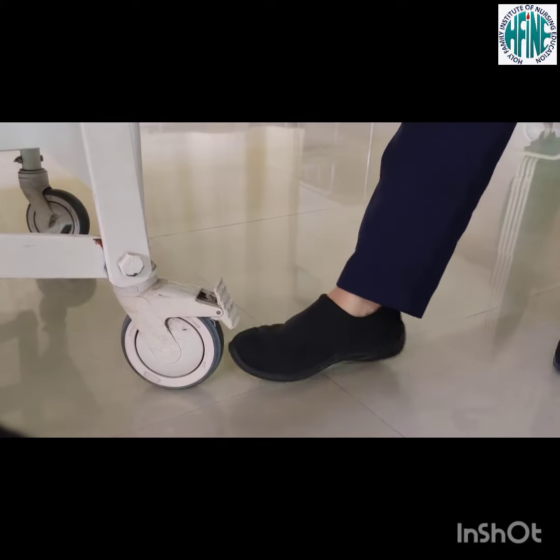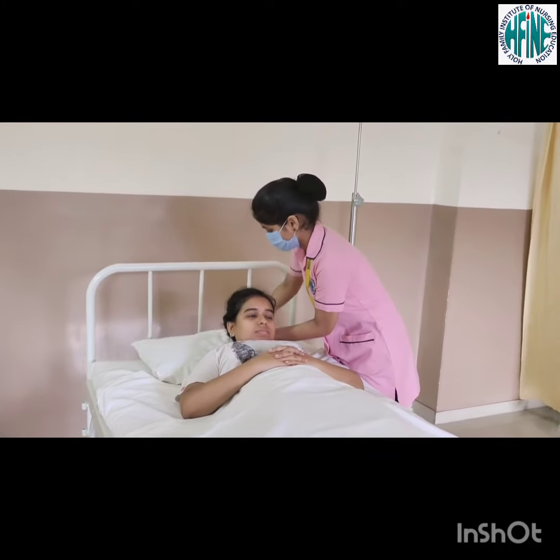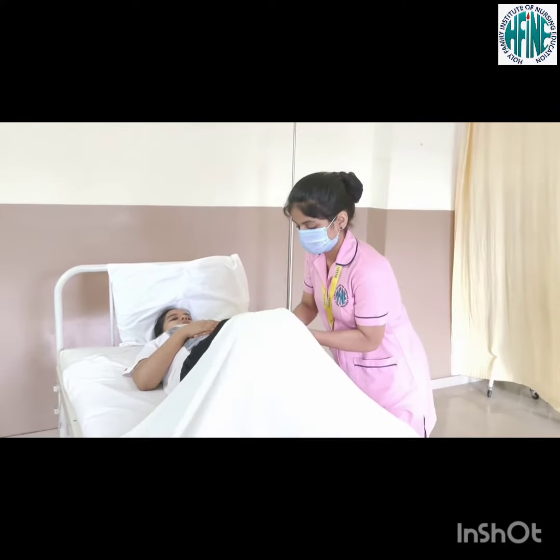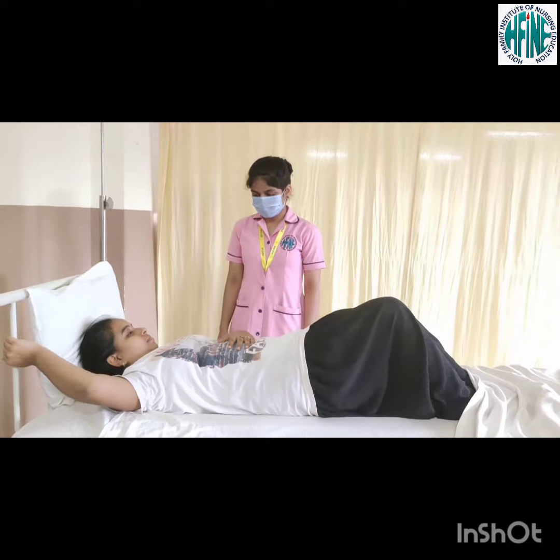Lock the wheels of the bed and raise the side rails on the side opposite to you. Remove all the pillows and place one against the head of the bed. Ask patient to flex his hip and knees and position feet flat on the bed. If patient can pull himself up holding a trapeze or holding the head of the bed, that should be encouraged.